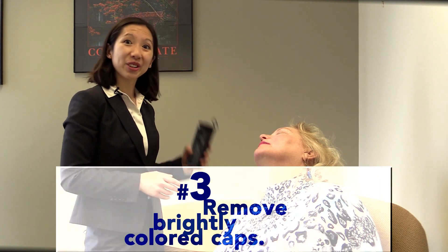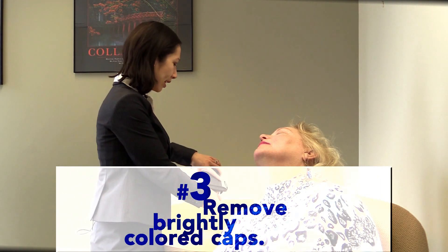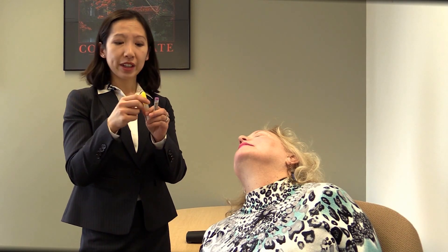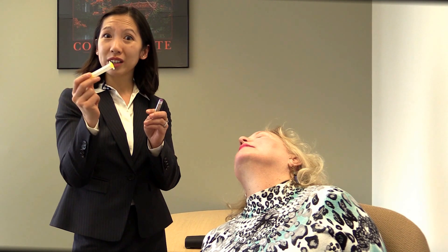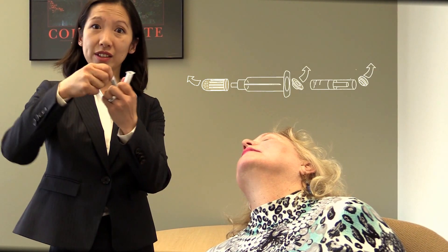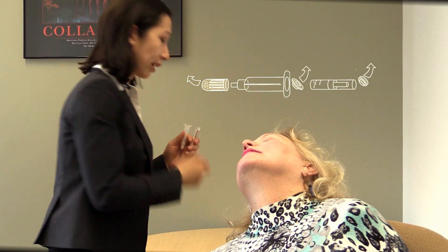In the meantime, while you're waiting for help to arrive, step number three is to get out your kit. What you will find is that there are three pieces to the kit. Take off every one of the brightly colored labels — take this off, take off the end of this, and take off this as well. So everything that's brightly colored, take off.